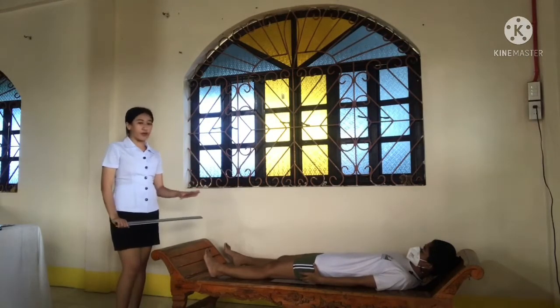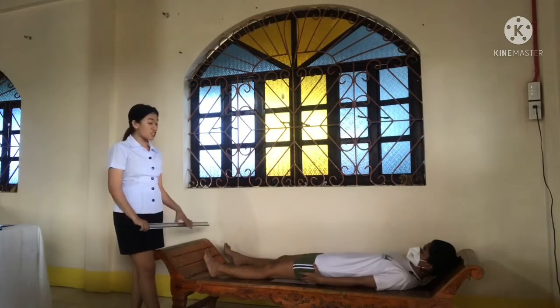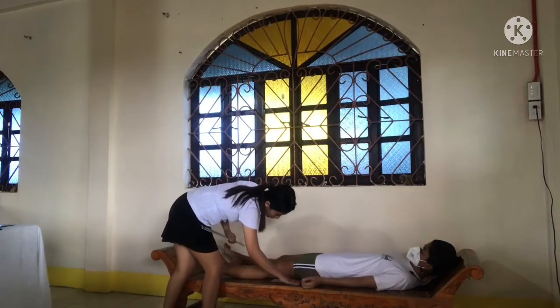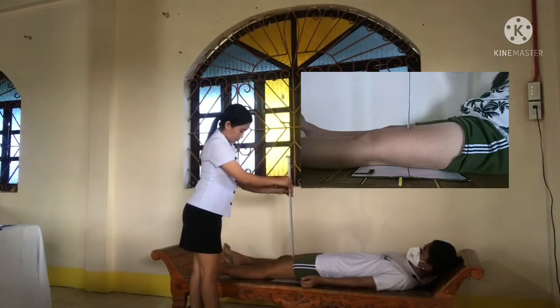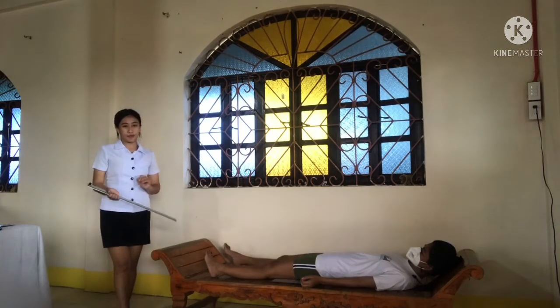When the patient is too tall to include the entire femur, include the joint closest to the area of interest on the one image with the knee. So place the bottom of the IR 2 inches below the knee joint. The central ray for this projection is perpendicular to the mid-femur and the center of the IR. So this shows an AP projection of the femur, including the knee joint or the hip.